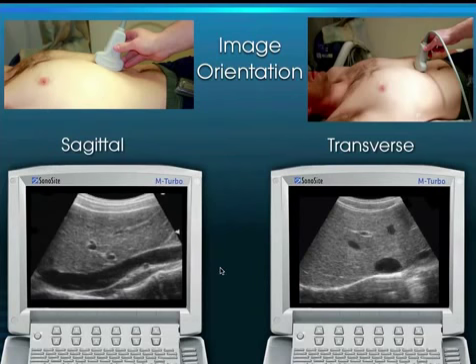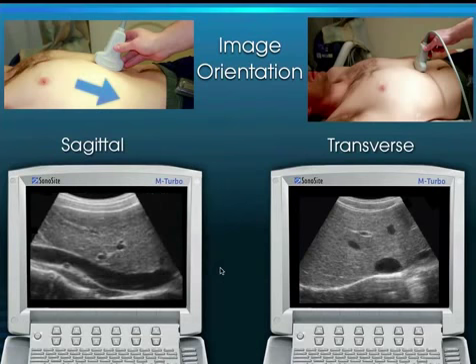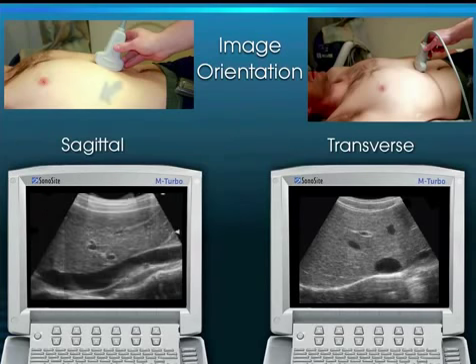But if I accidentally aim the indicator down towards the feet because I wasn't paying attention, well, now this IVC is upside down. And when that IVC is upside down, while you can still interpret it, it's an upside down image and goes against the convention in the United States. And over time, that appearance should feel like fingernails on a chalkboard to you. So I'm going to turn it back right now because that's having that effect on me now.